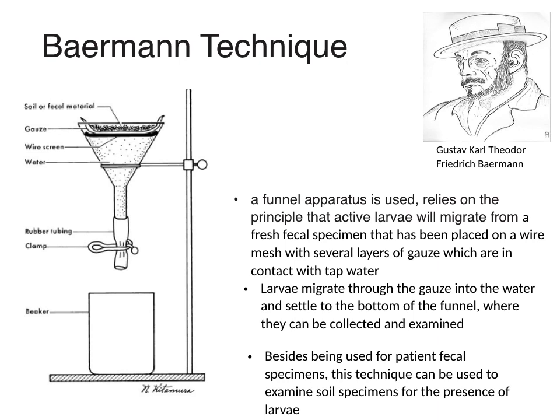This technique is also valid to examine larval stages in soil specimens as well. This technique was discovered by Gustav Baermann.